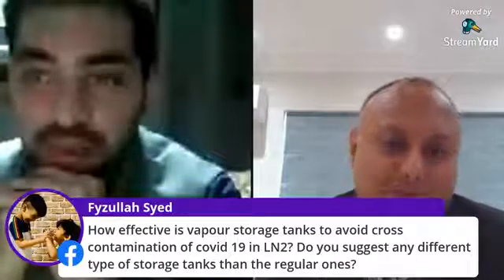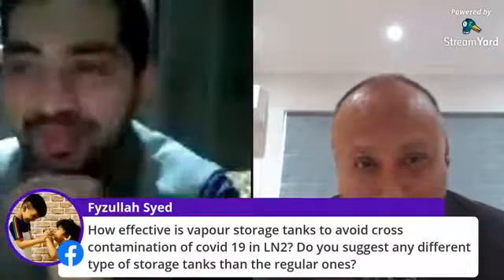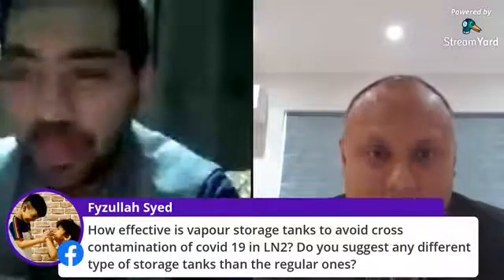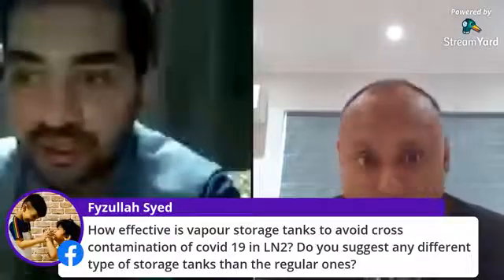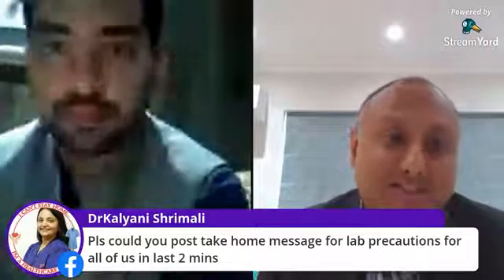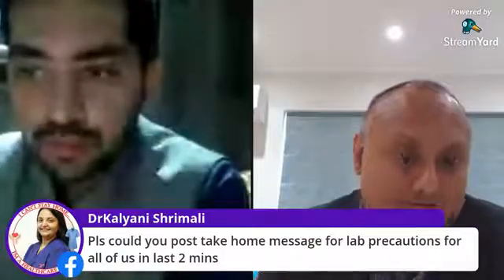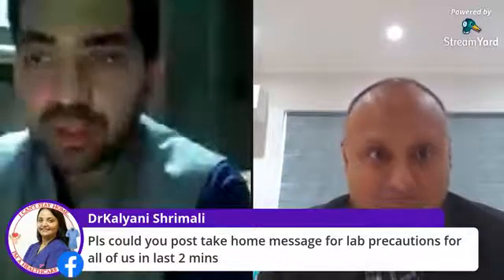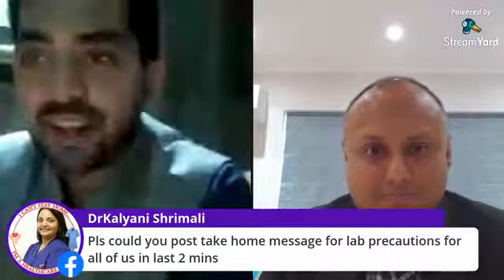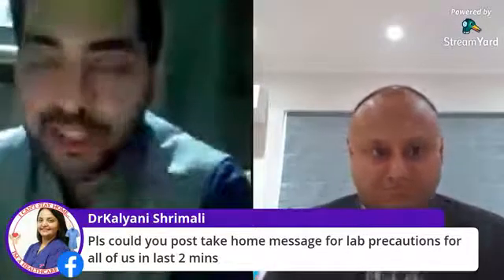No, I haven't used vapor storage, and I would never have the courage to use a vapor storage tank. I just feel that it's quite risky, in my opinion. I've always used wet storage systems, just because of the added advantage of time if something goes wrong. But in the current scenario, one of the things that ESHRE has mentioned is to consider freezing in a vapor storage system because there is no direct liquid nitrogen contact. However, as you know, Keshav, all these risks are theoretical. That's true. And the best that we can do in such situations is to take the maximum precautions that we can in order to offer the best kind of services to our patients.